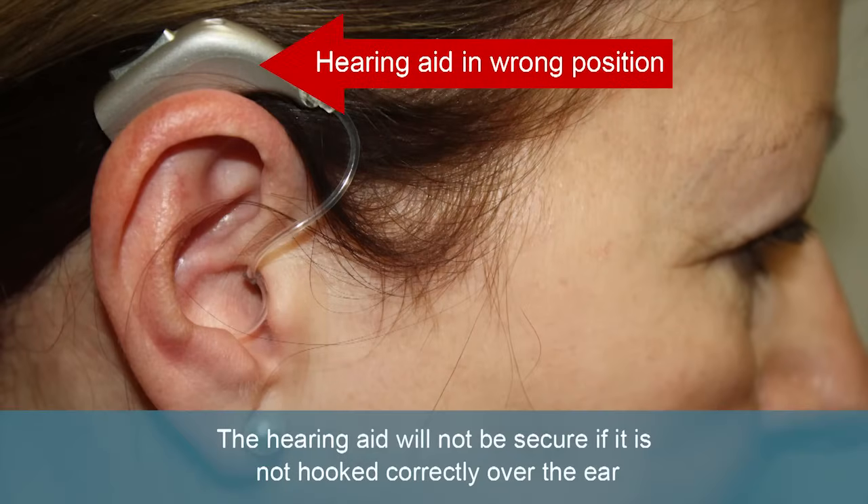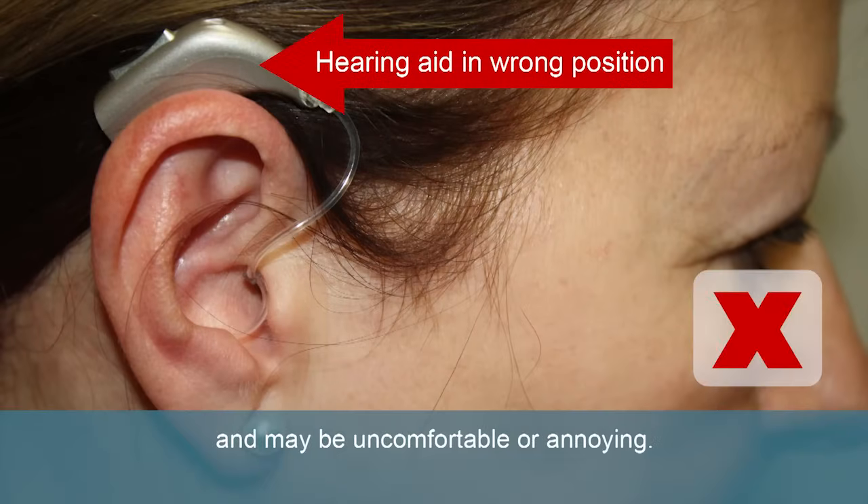The hearing aid will not be secure if it is not hooked correctly over the ear, and may be uncomfortable or annoying.